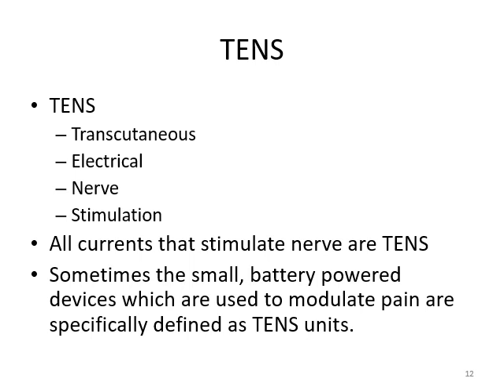But clinically and in routine practice, the small instruments which are battery powered and patients can also operate them by themselves, and their primary purpose is pain modulation or relief of pain. So this type of small handheld battery operated devices used only for the pain management are clinically defined as TENS modalities.